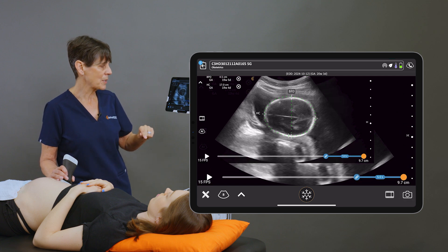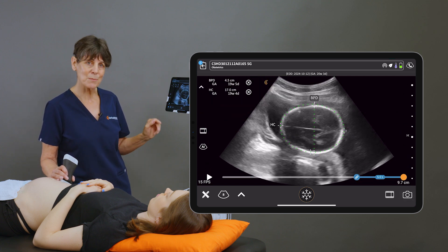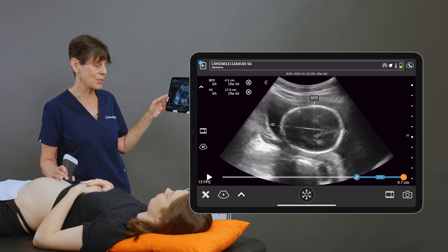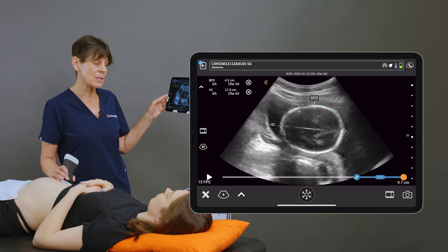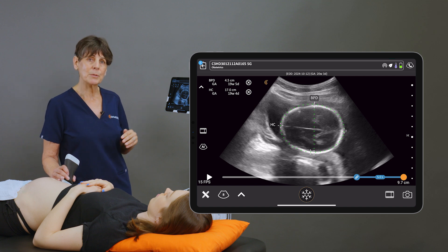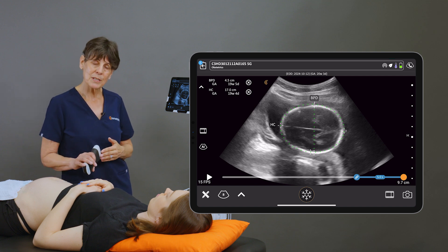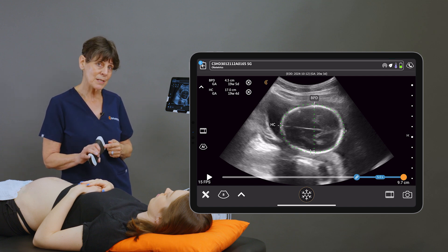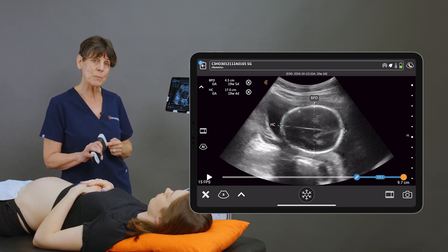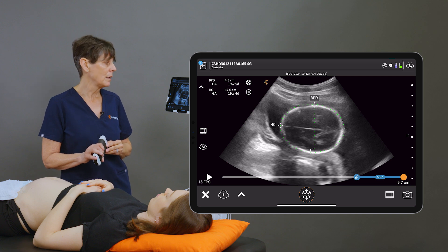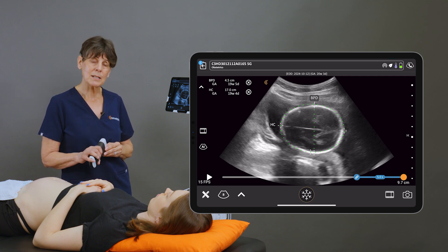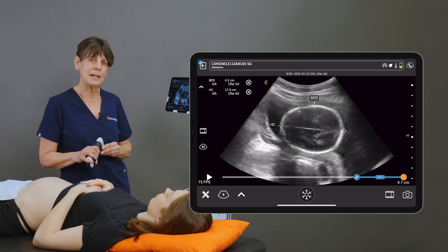We can take a picture and those measurements will be saved in the report package. Now once we've established the head circumference, the abdominal circumference, and the femur length — which I'll show you shortly — the system will calculate an estimated fetal weight and a gestational age.